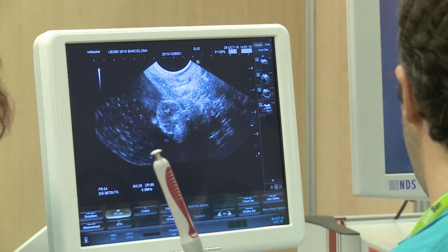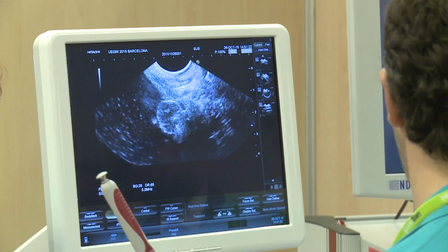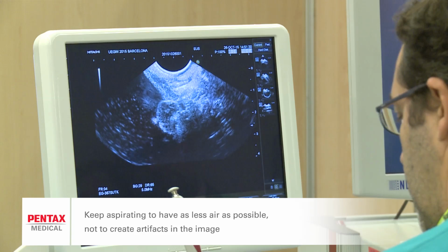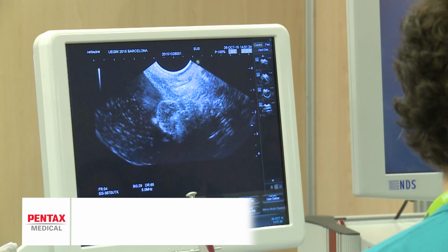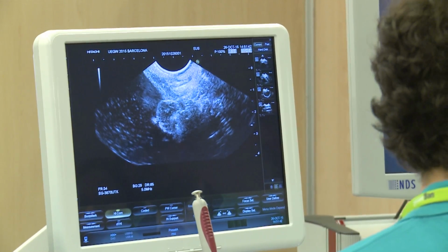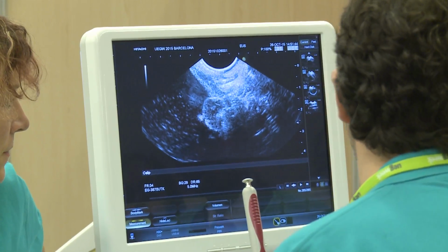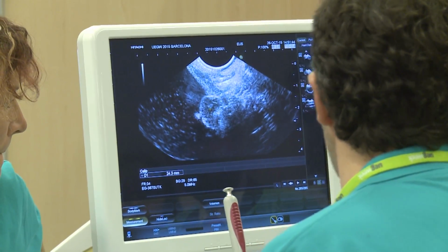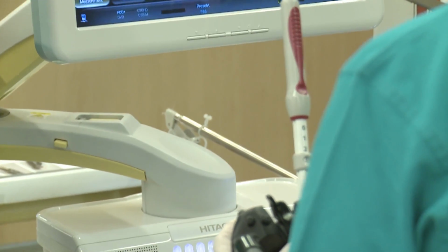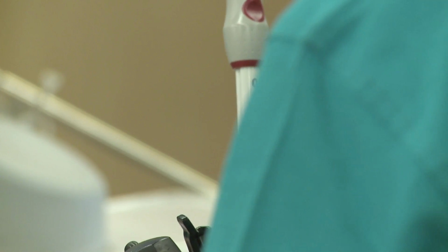And now we need to direct the puncture with the elevator. So if we want to go to this lesion down here, we need to direct to be here. So next step, always aspirating, because we need to have as little air as possible. And the next step is to release this part of the needle. This is a point here. You can ask me, what is this for? I've never used it, but what you can do is freeze the image and measure. Okay, if my needle is here, the distance from my needle to the lesion is 2.4. So to get a safe space, I will place the stopper here. That means that I will never go with the needle deeper than 2.5 centimeters.